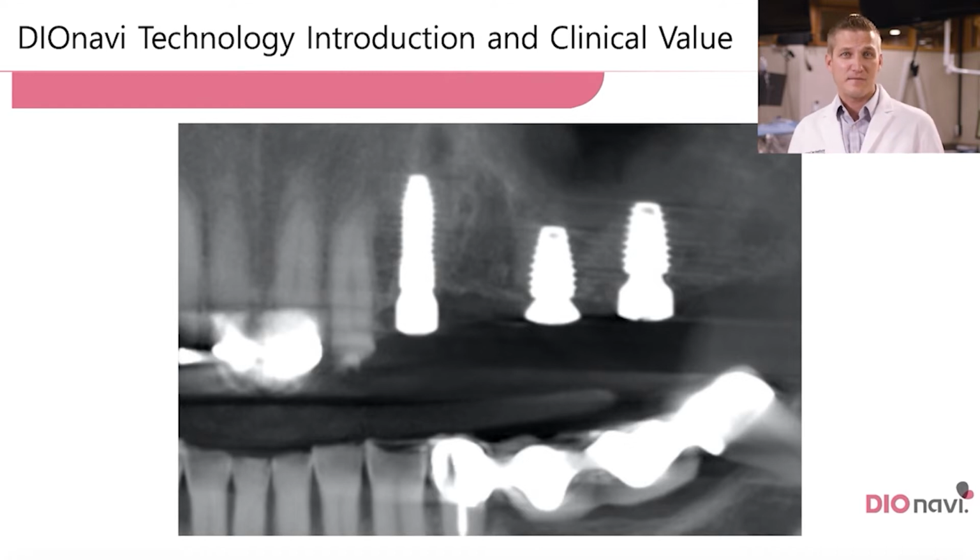I love a system that lets the patient feel like they're a king or queen. I love a system that lets me as the clinician feel like I'm doing a great job for my patient, saving time, saving stress, and to get 3 implants just like that, parallel, thoughtfully planned relative to our prosthetics in a way that is efficient, good use of time, everyone is winning. My patients appreciate it, my clinic appreciates it, I certainly appreciate it as the clinician. I think that tells a big story right there.